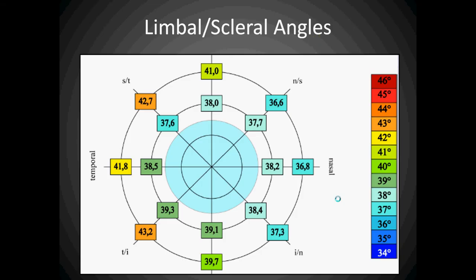When measuring the angles at the 15mm cord diameter, the inner circle, and at the 20mm cord diameter, we can see that the eye is fairly symmetrical in angle around the clock at the 15mm cord — there is approximately 1.7 degrees of differential. However, at the 20mm cord, the outer ring, the eye has far more asymmetry: 6.6 degrees of differential around the clock on the sclera.